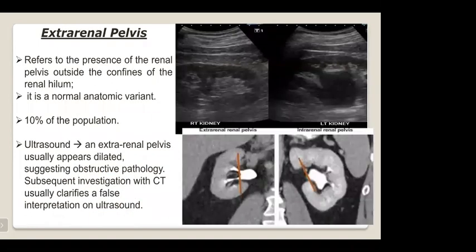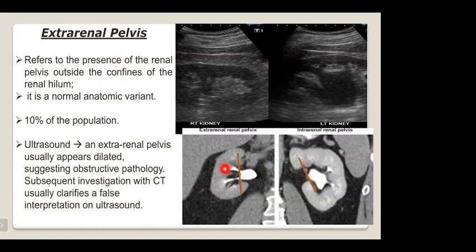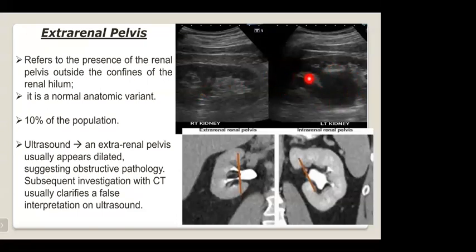This is an example of the normal variant called extra-renal pelvis, which refers to the presence of the renal pelvis outside the confines of the renal hilum. On the right side, the pelvis is within the confines of the renal hilum, while on the other side it is outside. It is a normal anatomical variant present in 10 percent of the population. On ultrasound, it may appear dilated and suggest obstructive pathology, but subsequent CT investigation usually clarifies the false interpretation.